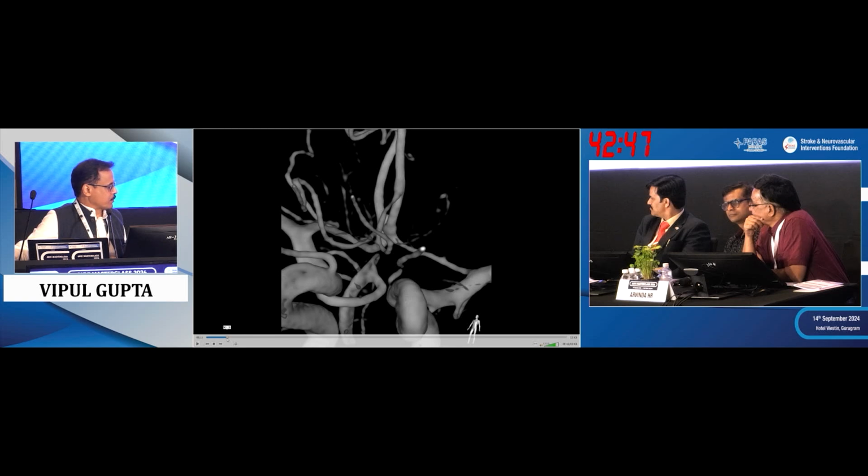And there is always a residual filling. With a stent, I'm comfortable, it will go away. But a stent is not changing the flow dynamics, it's quite safe. And the stented segment will not even go into vasospasm. So yes, long time back, when we didn't have great stents, I have tried to place coils in these, and I did. But in the current era, I would use a stent.